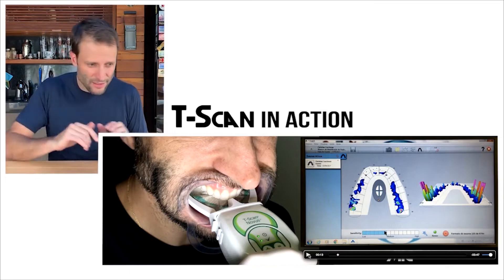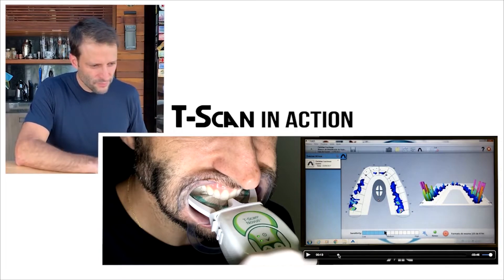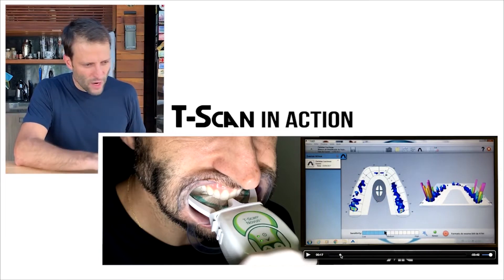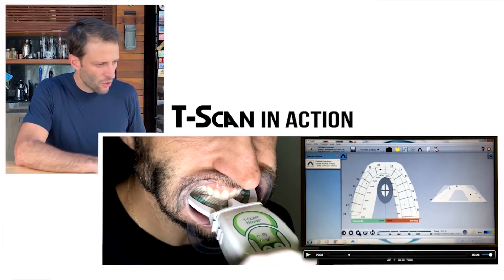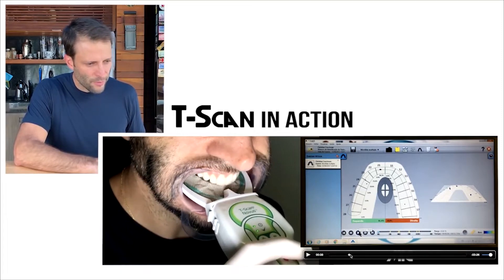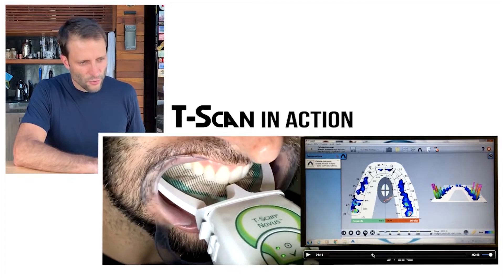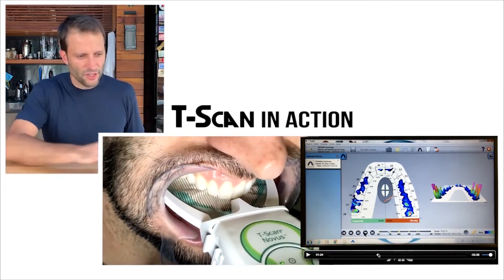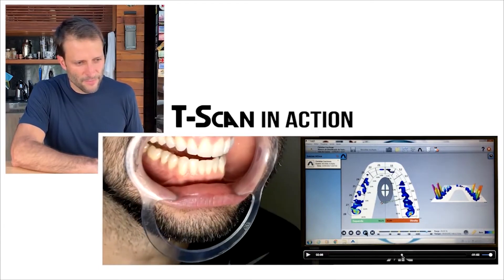On the right side it's more balanced. As I'm biting together, in one second we can see the load distribution. I'm opening and closing a couple of times so we can see the reproduction of these contacts and have a better evaluation.